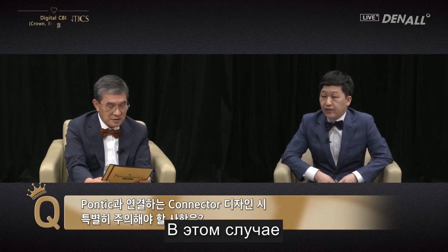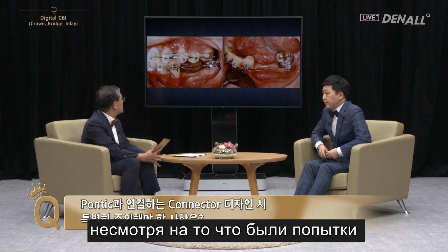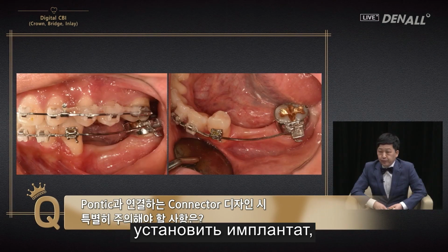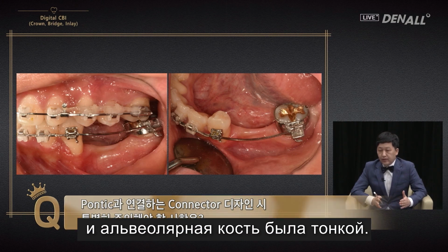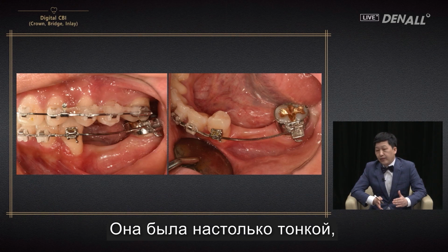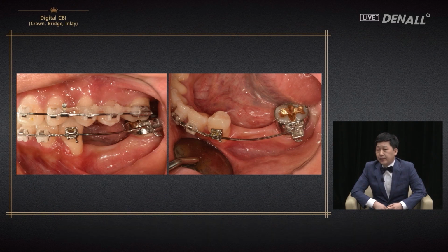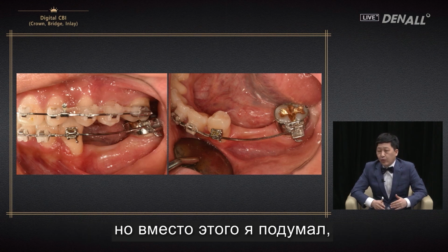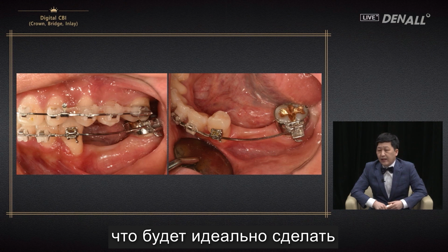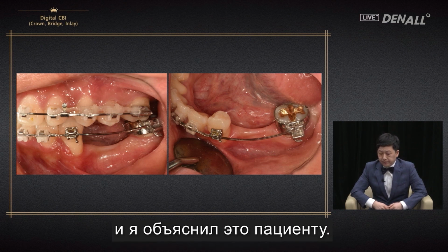This case was originally planned for an implant. Although attempts were made to place the implant, because the bone quality was very bad and alveolar bone was very thin. Yes, it's very thin. And it's so thin that ridge splitting was impossible, and I considered doing bone graft and placing implant, but rather than that, I thought it would be more ideal to do conventional bridge, and this was explained to the patient.